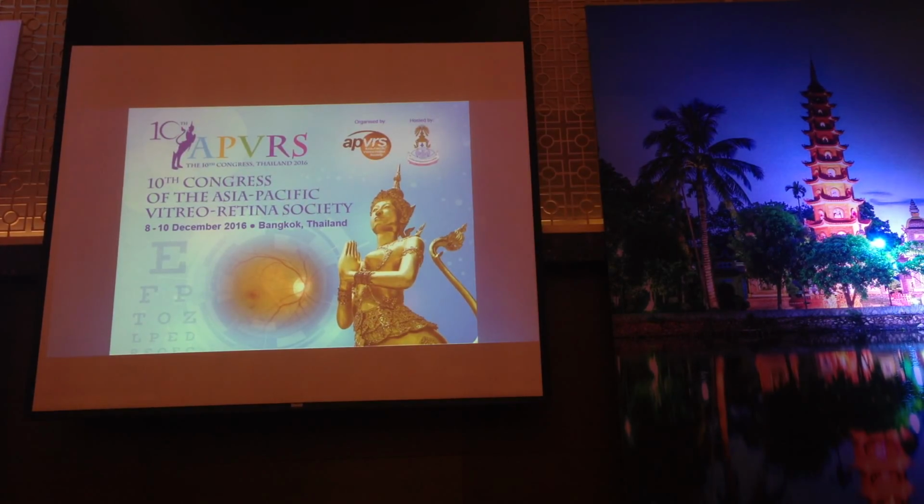But in OCT technology, we don't use that kind of electronic resolution. We use, for example, 2 microns. It means that if 2 points are 2 microns apart, then the machine can recognize them. If it's less than 2 microns, the machine cannot recognize it. That's a little bit different between those 2 resolutions. Thank you for helping me.